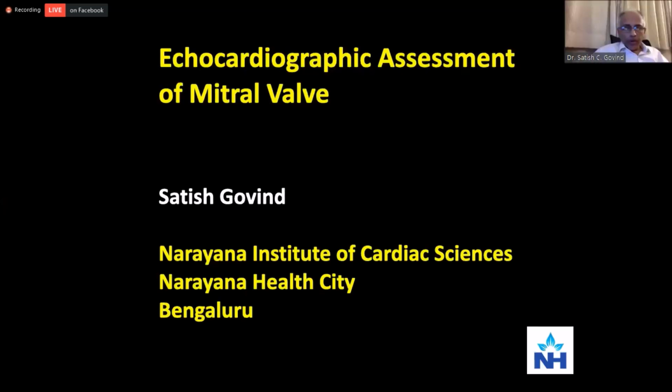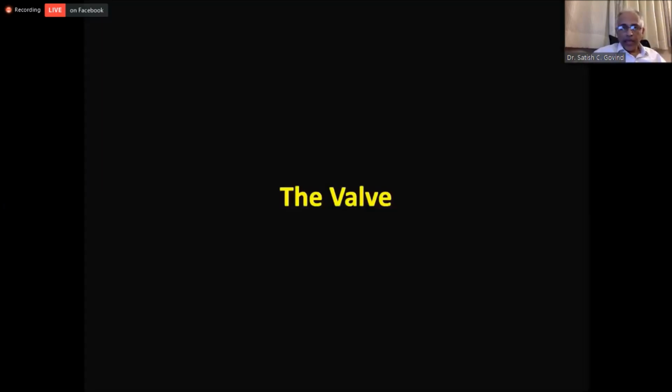Thank you. So the mitral valve has got a long history. It is the valve which sort of set the motion as far as echo is concerned. So it's got a lot of background behind it. It's a broad topic, so I'll focus on some basic and some key areas.